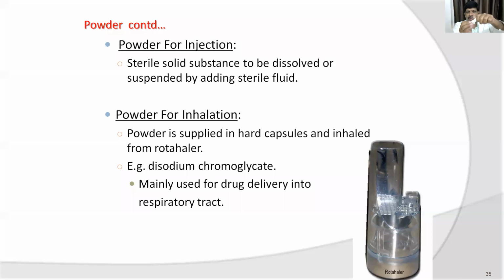How does it work? You have to twist it open, and then a specific capsule is used. You have a groove inside for placing the capsule. You put the capsule inside it and then lock it, and then you press the button.